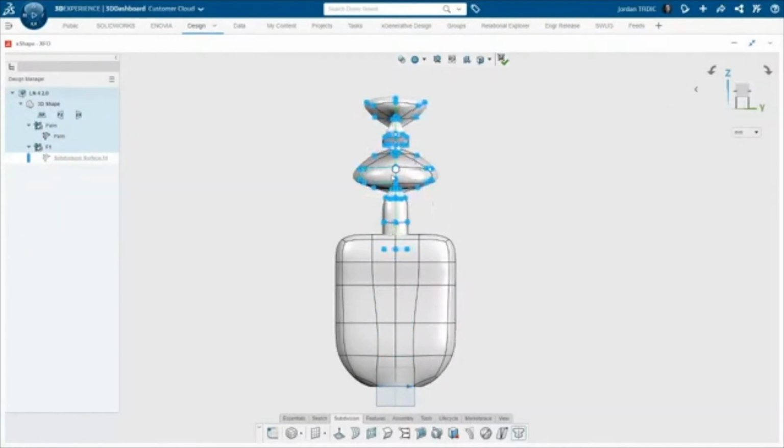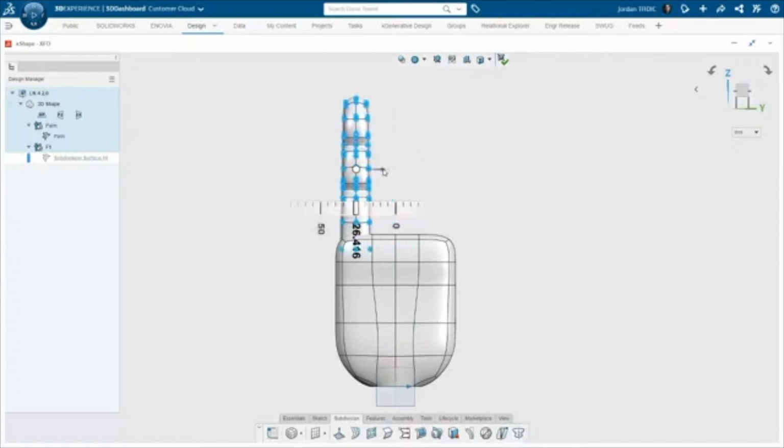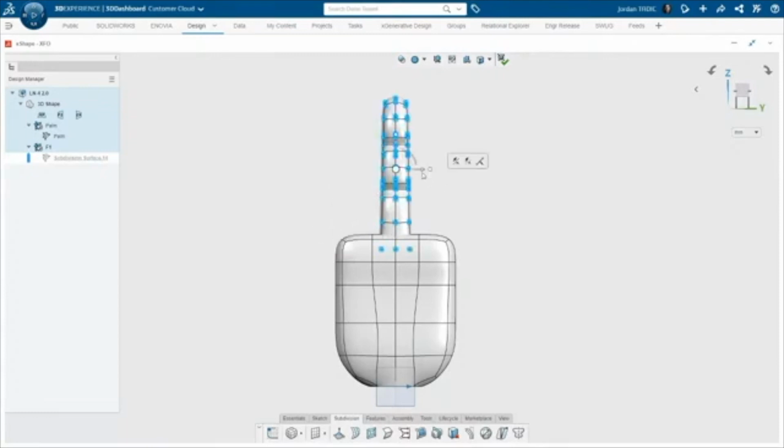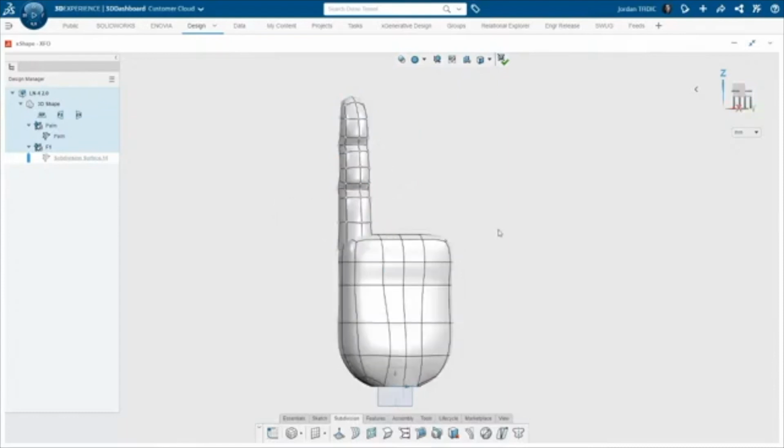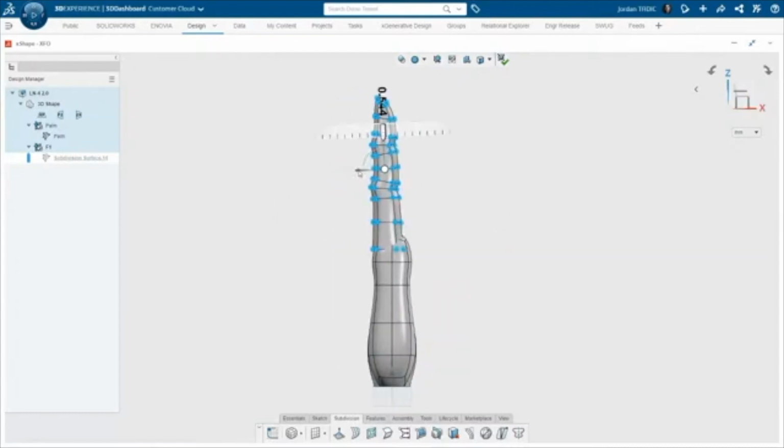And then I could try and translate that to the side and see it totally doesn't work with symmetry on. Oh, that doesn't make sense. Forget about that. We've got to turn symmetry off. But I can see when I'm translating it to the side, it's about 28 millimeters. So I click it again. And this time I type in negative 28 millimeters, because I know to type in negative because when the robot pops up, if the arrow's pointing this way and I want to move in this direction, I'll just type in the negative value of it.